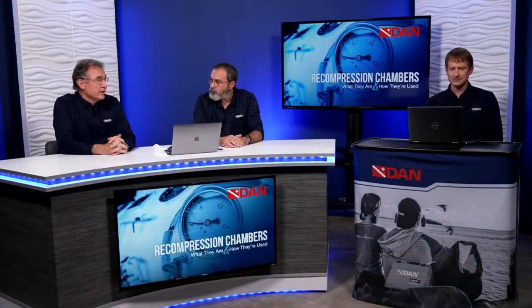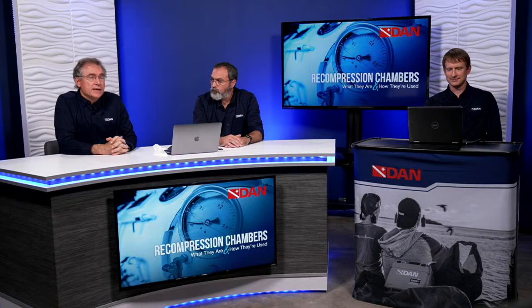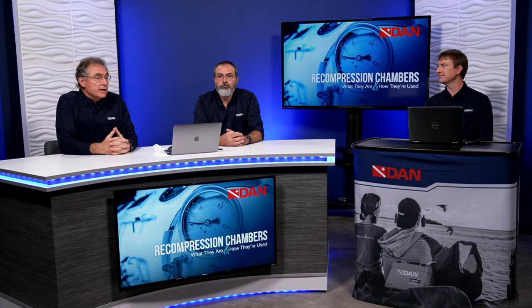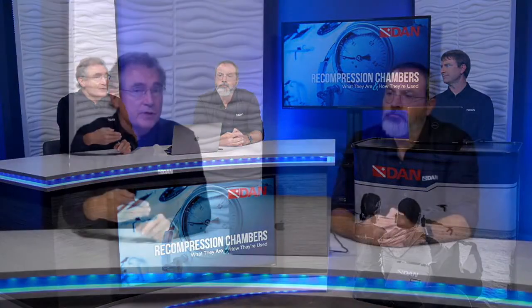How does the chamber continue to run if the power goes out and the compressors stop working? So the first part of that answer, Brian, is planning. That's part of what we try to do here at DAN, to help chambers understand some of these safety issues. It should be designed to handle a power outage, and typically on an island where power is a big problem, they will have a high pressure compressor, so they will pump up their storage banks, their big cylinders, up to high pressure. And when they run the treatment, they'll be using high pressure air, not air coming from the low pressure compressor. So that would be one way to continue the treatment.